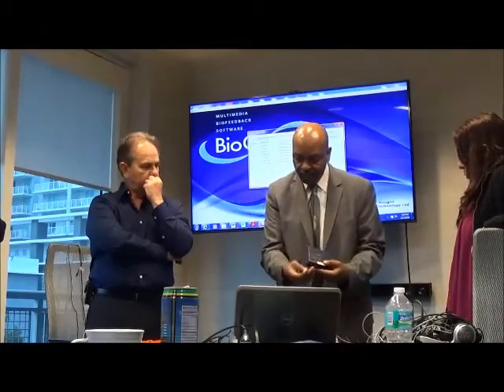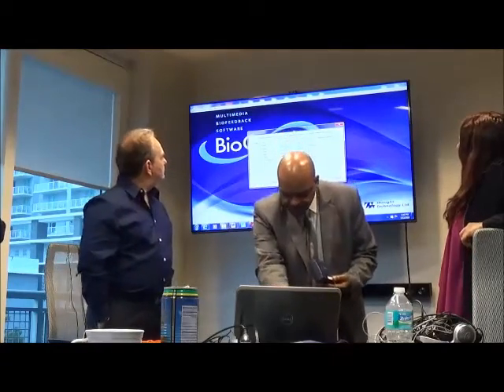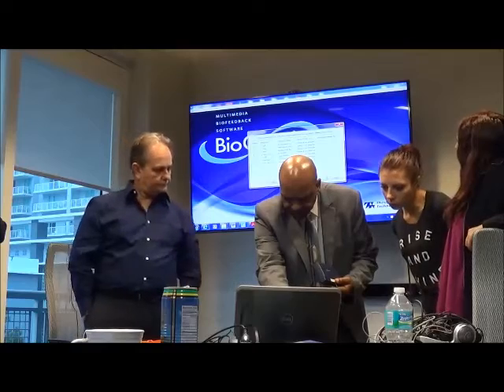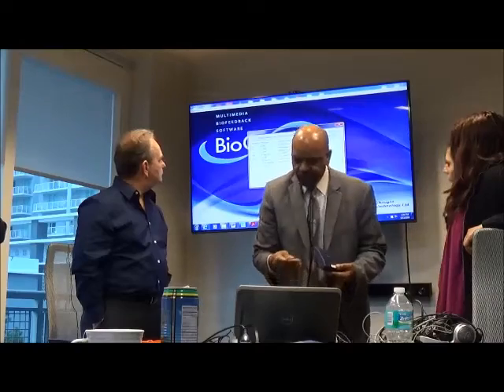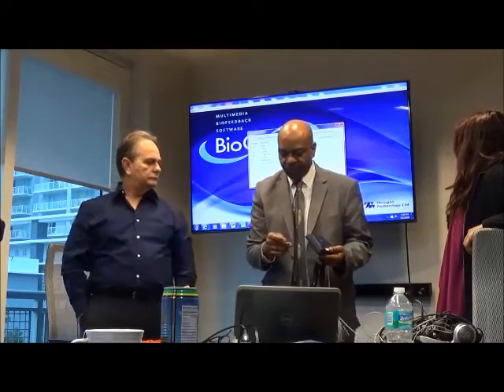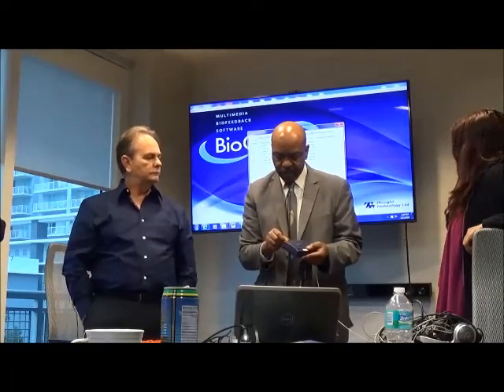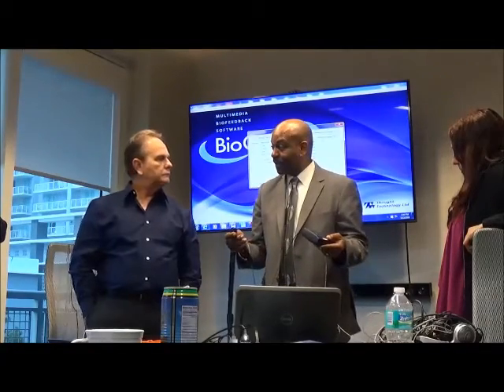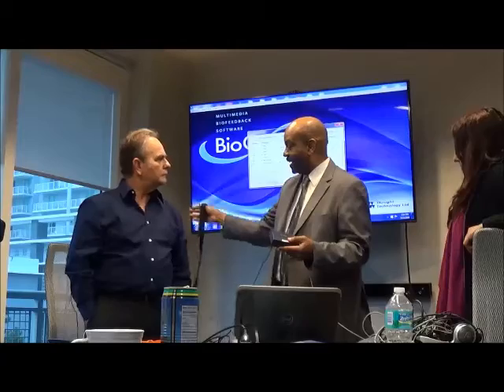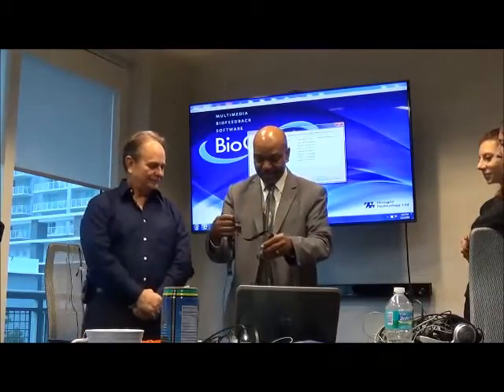So for instance, if we don't know where to plug the sensor in, we look on here. This is a respiration sensor. The one that says G is abdominal respiration, and the next one would be H for thoracic respiration. We're only using the one for now. So we would plug that into G. I just take the cable, line it up with the dot, and then plug it in. Now, very helpful what Dr. Palacios did: unplug everything and lay out the cables separately, because otherwise they become spaghetti. So this is the respiration sensor.